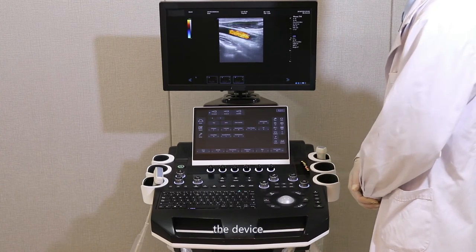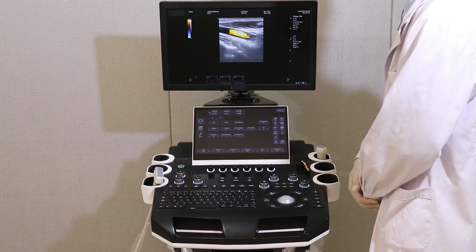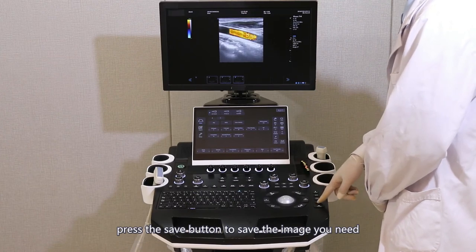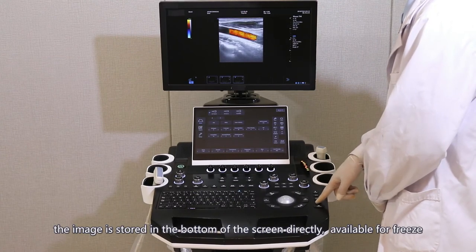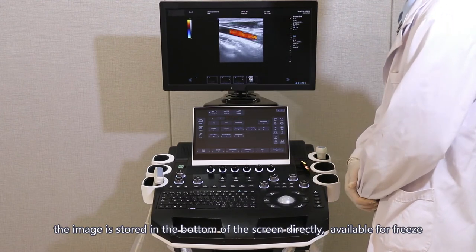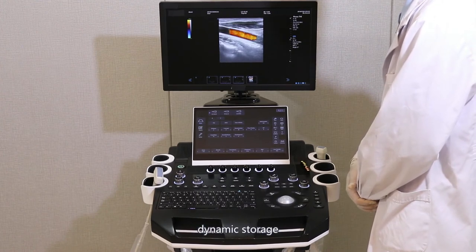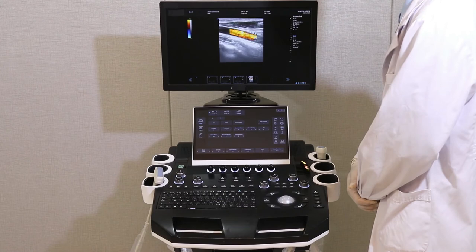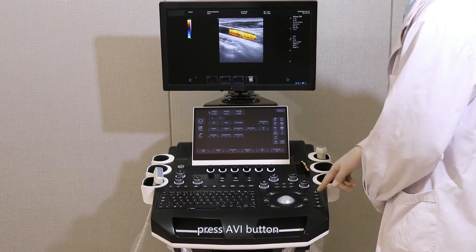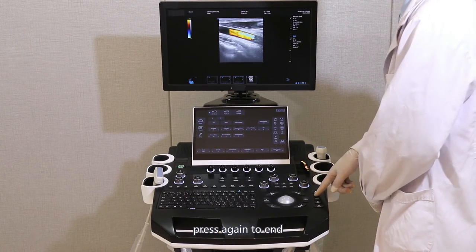Image save: the device supports static and dynamic storage. Static storage: press the save button to save the image you need. The image is stored at the bottom of the screen directly, available for freeze or real-time status. Dynamic storage: get a satisfied image and press the AVI button to begin saving the video; press again to end.